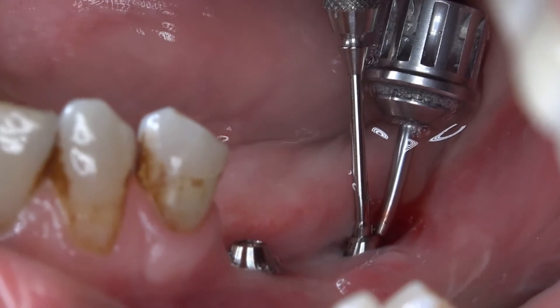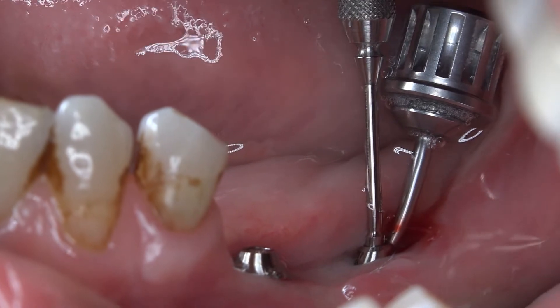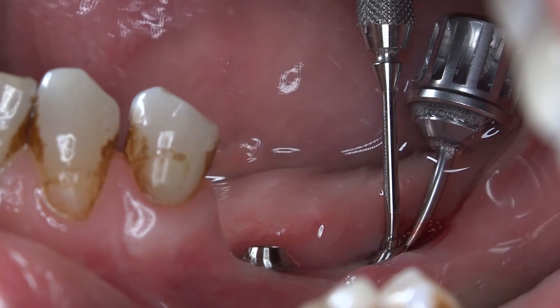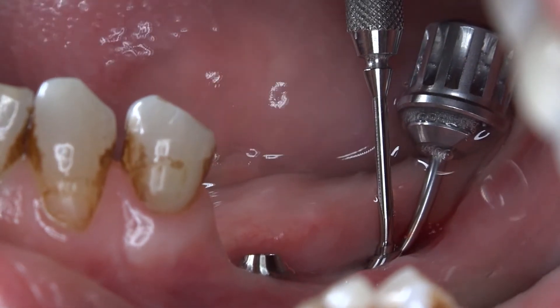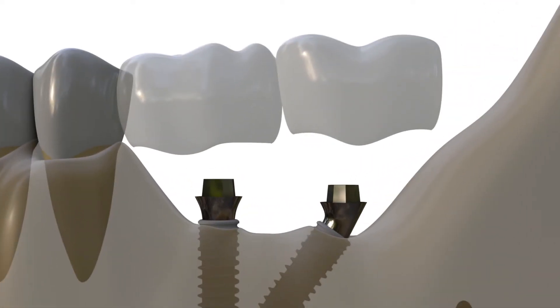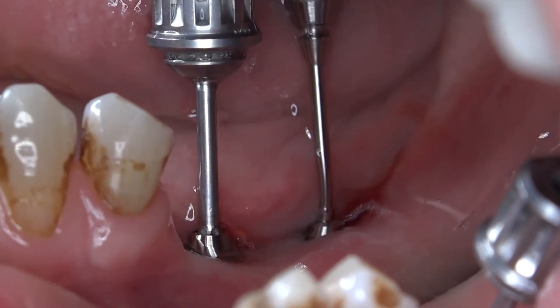Two different screw holes are present for the multi-unit screw and the suprastructure screw in angulated multi-units. The multi-abutment screw hole is parallel to the implant, while the suprastructure screw hole is also in the occlusal direction. After choosing the ideally-angulated multi-abutments and torquing them on the implants, the suprastructure screw holes are now parallel to each other and we may continue with impression making.